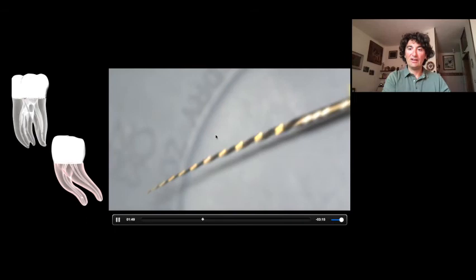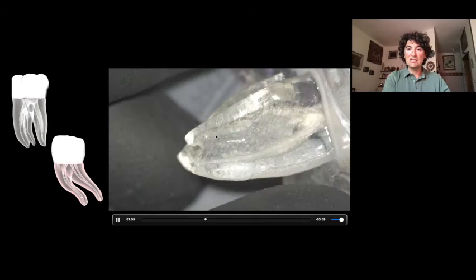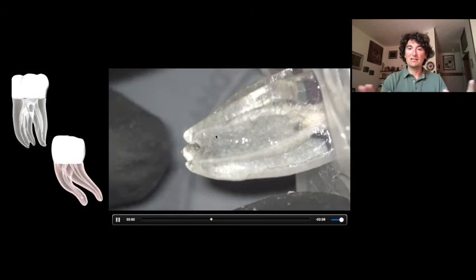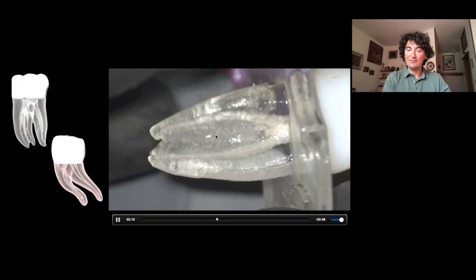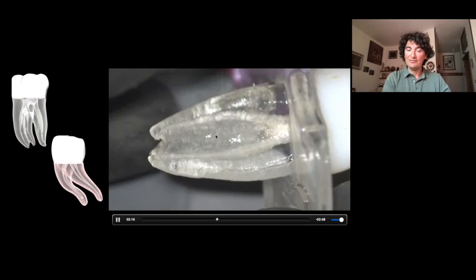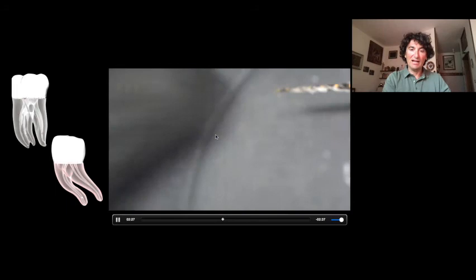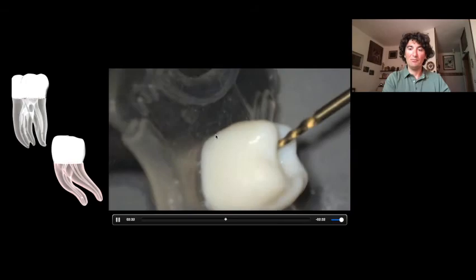After I introduce the first glide path file. As you can see, I can follow the anatomy — there is a deep curvature in the apical region — just thanks to these files I am able to enlarge the root canal system gradually. After, I can use the first shaping file from the MG3 kit: 20-.04. As you can see, it is heat-treated but not excessively, so I don't lose the cutting efficacy. This is a secret of Perfectendo files and the MG3 system: different heat treatments applied on the basis of the specific file being used. The same story when we have coronal interferences and a deep coronal curvature — the most difficult tooth. What to do? Remove coronal interferences first, then enlarge the first part in crown-down. In this way, all files introduced later into the root canal system will find the path more easily.